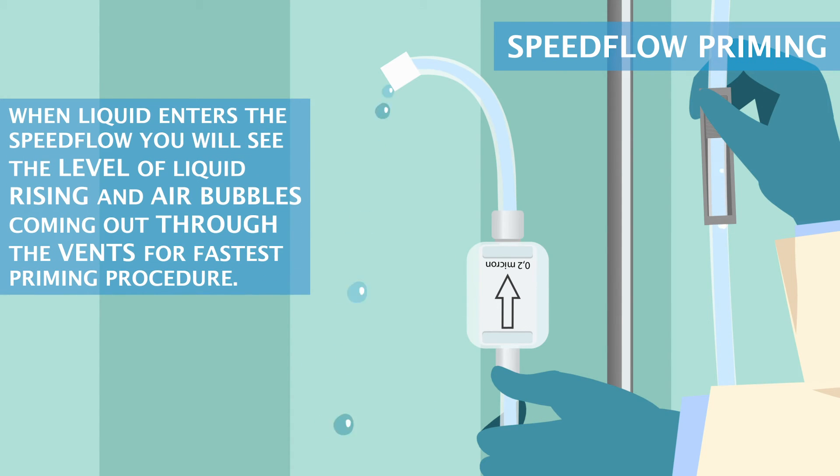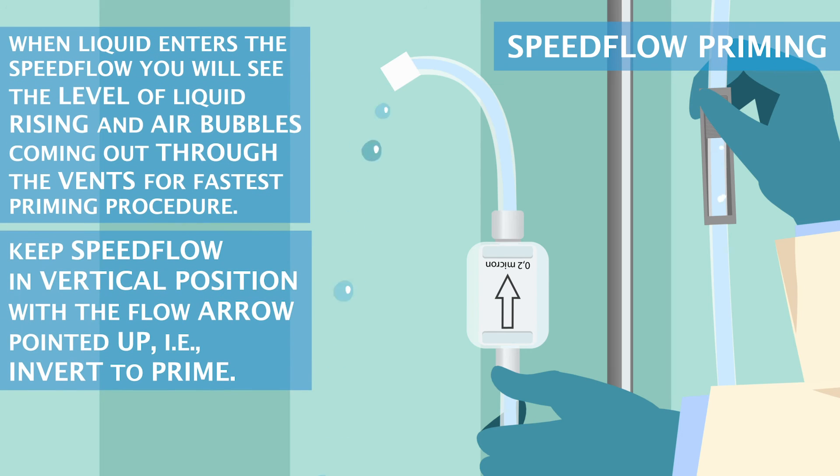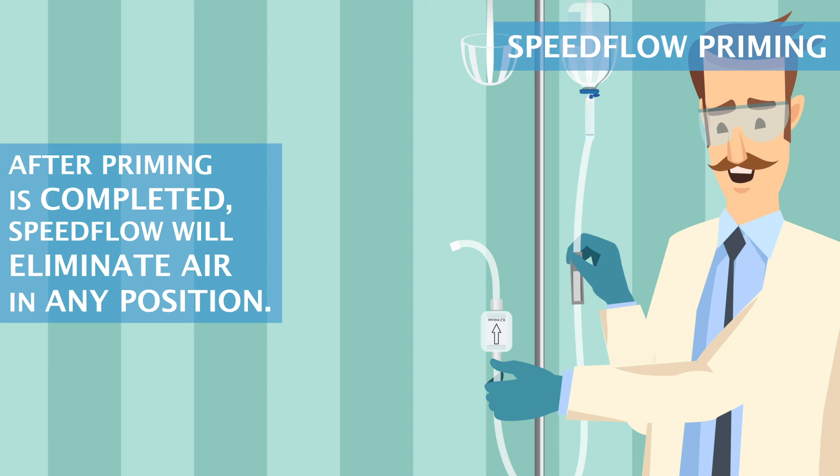Speedflow priming. When liquid enters the Speedflow, you will see the level of liquid rising and air bubbles coming out through the vents. For the fastest priming procedure, keep the Speedflow in vertical position with the flow arrow pointed up — i.e., invert to prime. The filter will eliminate air faster that way. After priming is completed, Speedflow will eliminate air in any position.